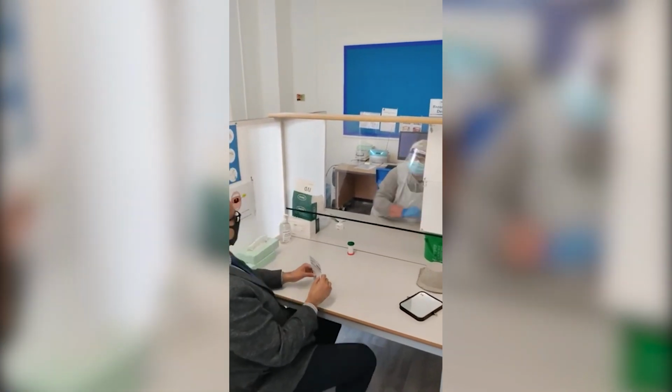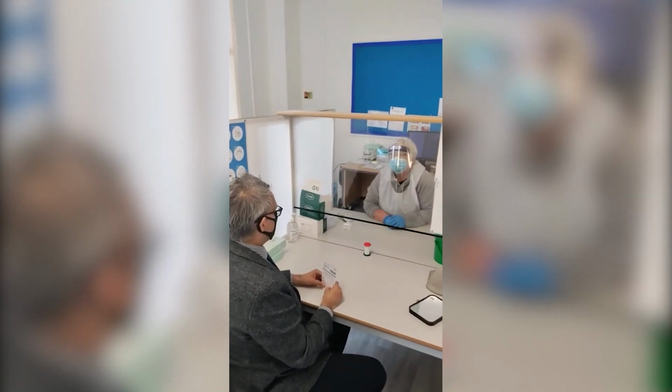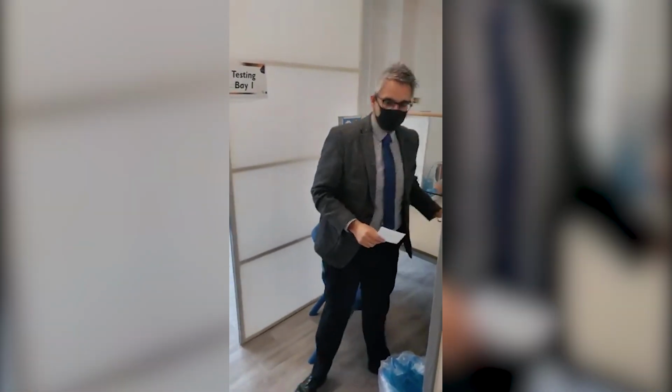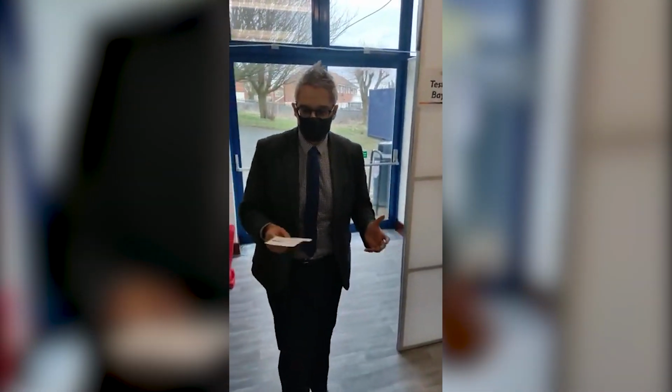Yeah, and we'll come out and tell you, and then turn that over so nobody else uses this till it's been cleaned. Yep, brilliant. And just to reassure our viewers, the whole table and the chair and all the equipment will now be desanitised by a member of our cleaning staff whilst I go and wait in the waiting area.